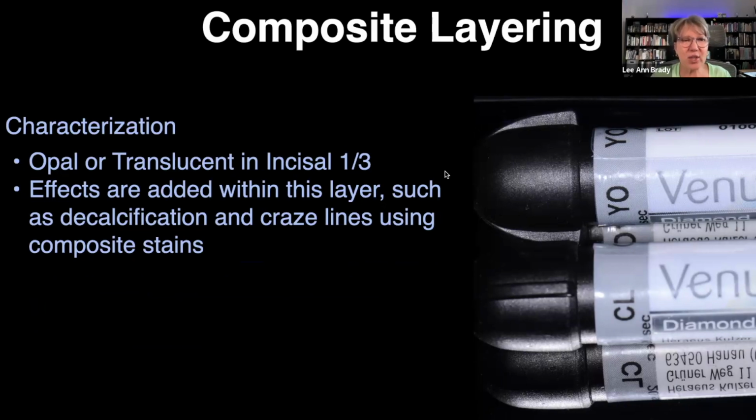And so here what we're going to do is decide, do I need opal, translucent in the Gradia Sculpt system, the juvenile enamel, the adult enamel. This labial 0.5 millimeter of composite is going to be very translucent because it's really mimicking the natural enamel. And you might even want to choose a specific type of composite called a microfill because it's highly polishable.